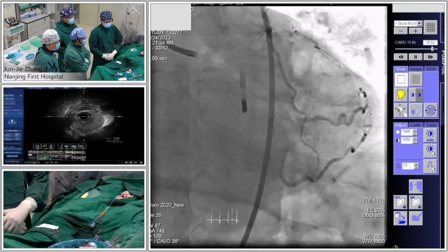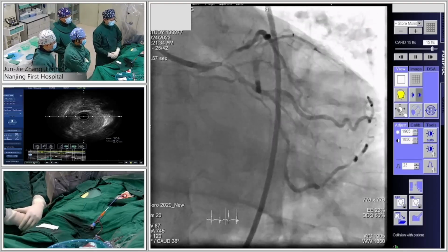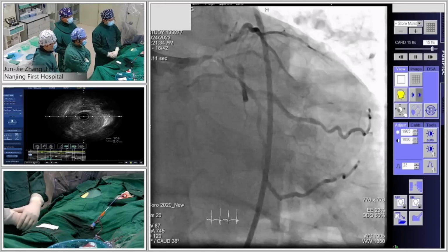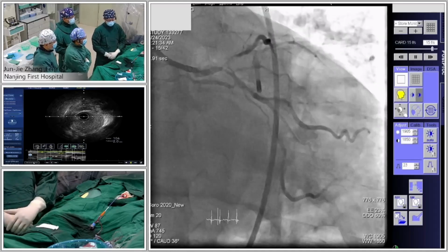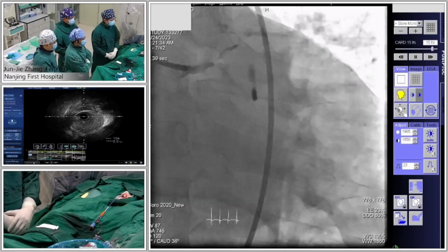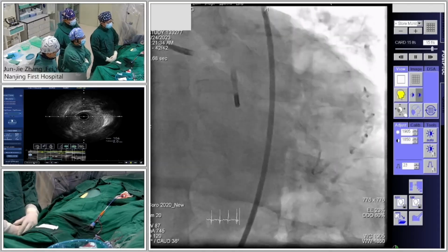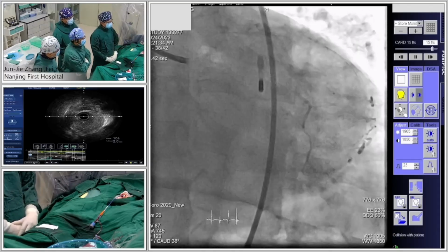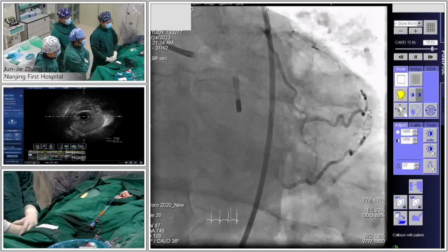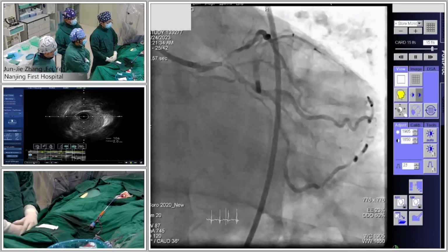Even though the renal function is okay, and the echo, I mean the EF value, was also okay for this patient, the left main is unprotected. I also think IVUS is the best choice. Yeah, I agree with the option. You use IVUS guidance because it's a high-risk patient with impaired LV function. Considering reduced contrast consumption, I also prefer IVUS to OCT guidance in this case.